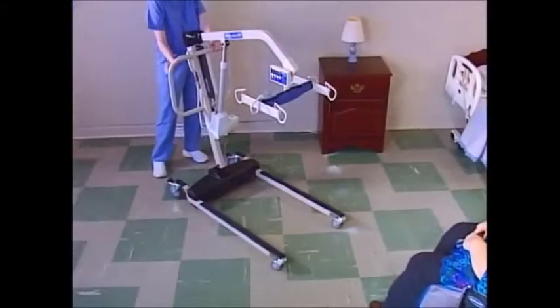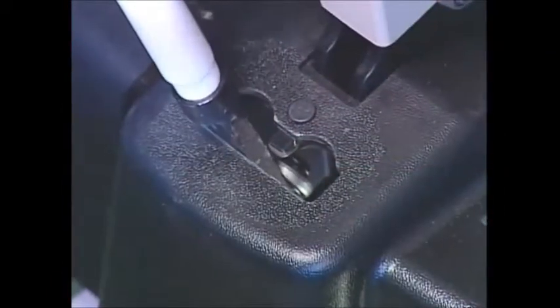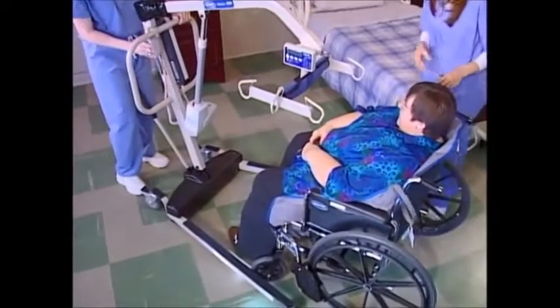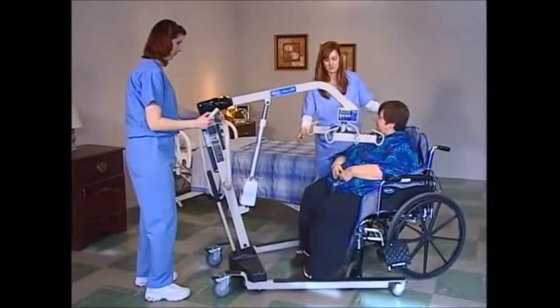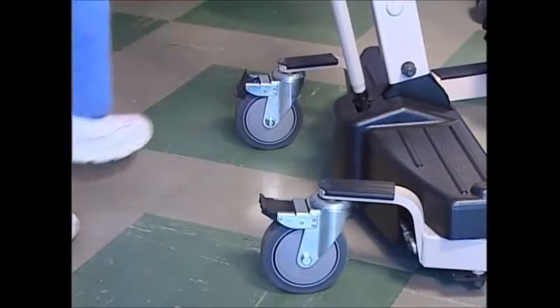Make sure that the lift's legs are in the maximum open position for stability. Use the shifter handle to open the legs of the lift. Position the lift so it's over the wheelchair. Lower the boom so you can attach the sling to the swivel bar. Lock the rear casters to secure the lift.